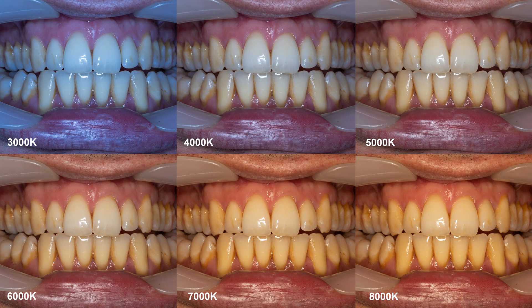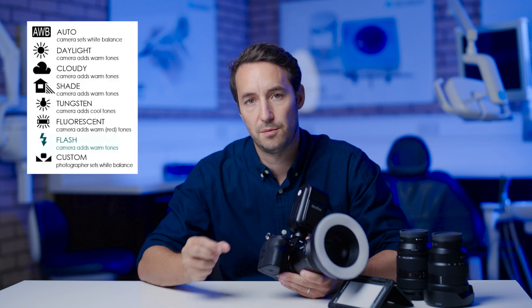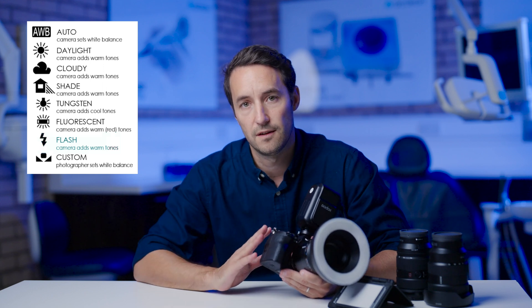The higher the Kelvin, the warmer the colour, and the lower the Kelvin, the cooler. Almost all on-camera flash sources like this one deliver light with a cool tint, therefore setting your camera to a flash preset white balance will add warm tones to counteract this.